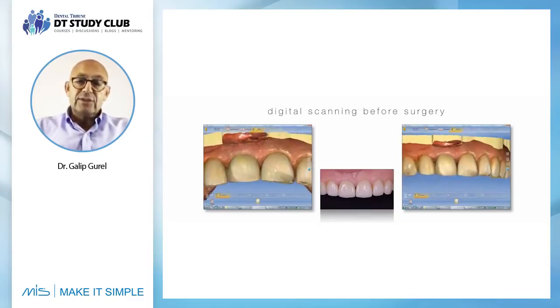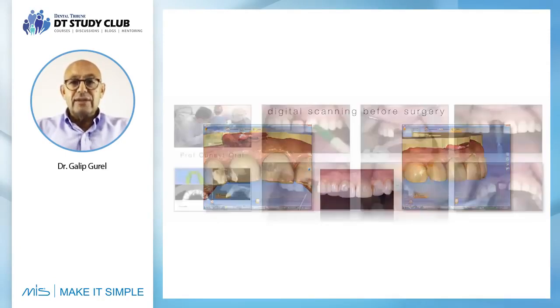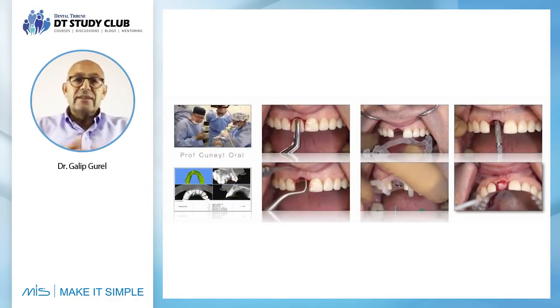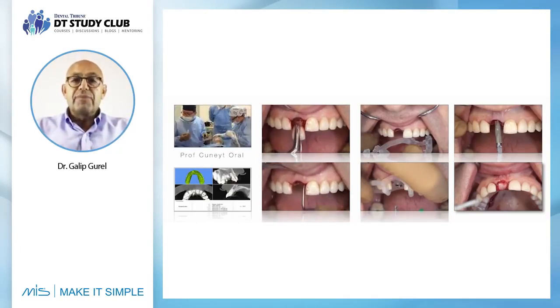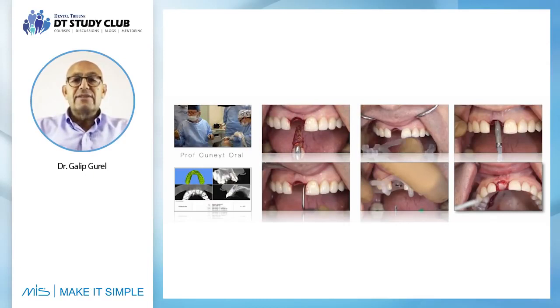And again, this was also a guide for us to prepare our surgical guide, so we kept it aside. And then we will talk about this in the future cases: the scanning of the original teeth, the scanning of the wax-up, in this case again the original tooth, and then the STL file creates this guide for us to place the implants.